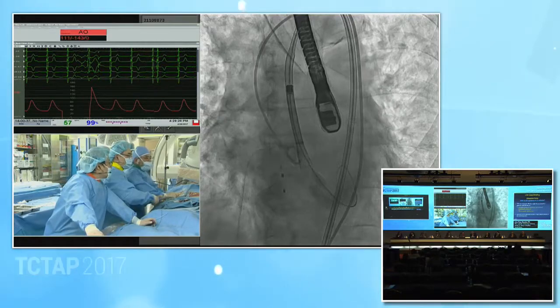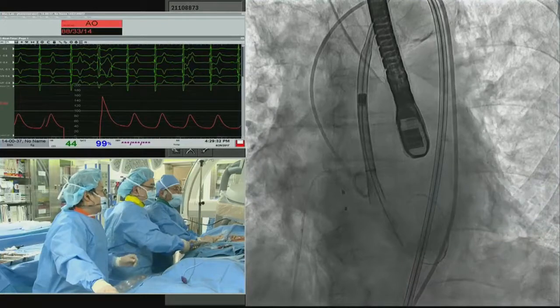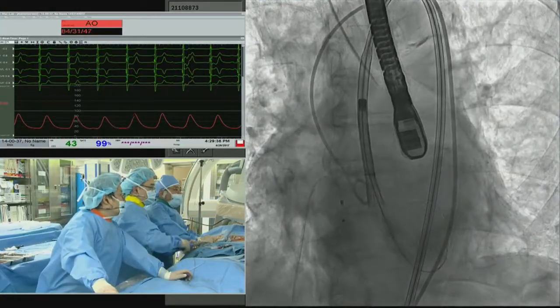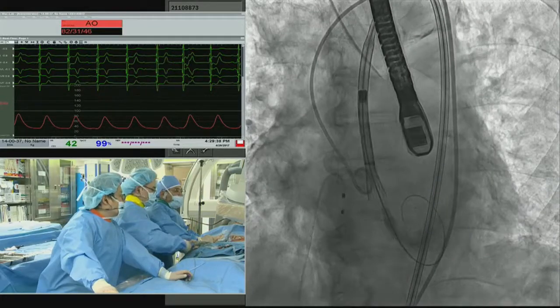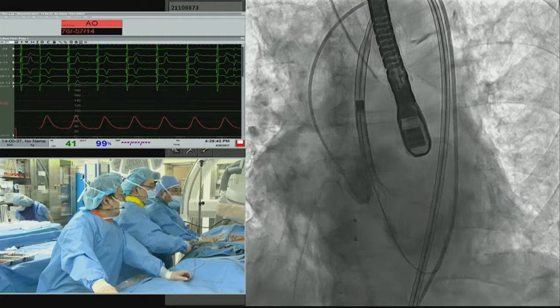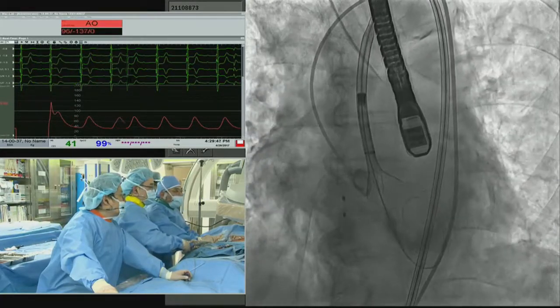Be coaxial with the orifice. So you moved it up even more. You're just at the annulus, actually. And now redeploying. Yeah, redeploy. Just a moment. Stop. Test it. Oh, okay. Yeah. You're just barely in the annulus. That's as good as it gets, probably.